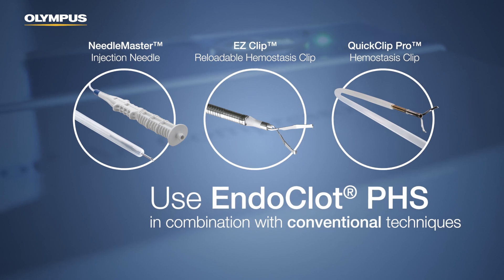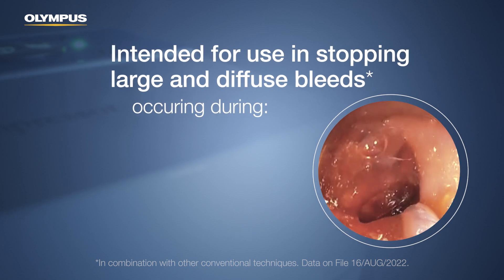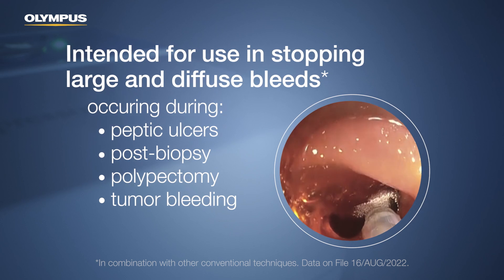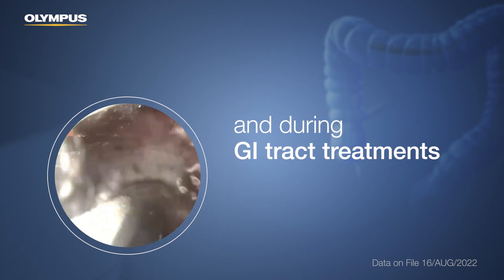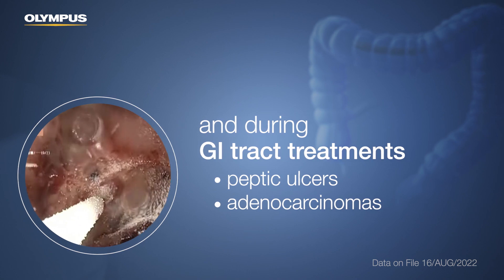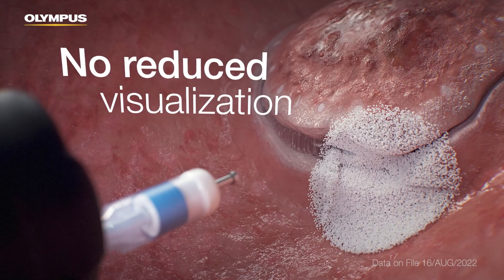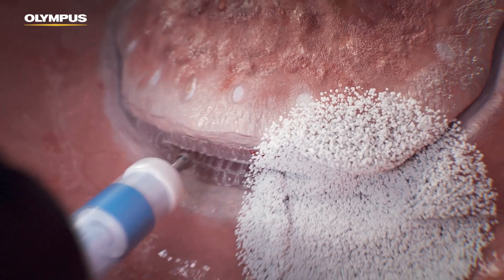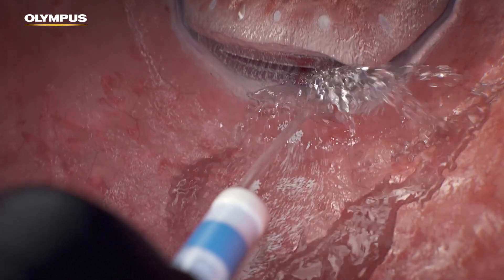It is intended for use in combination with other conventional techniques for large and diffuse bleeds, such as those occurring during peptic ulcers, post-biopsy, polypectomy, tumor bleeding, post-EMR, and ESD. Endoclot PHS is also indicated to stop bleeds while treating peptic ulcers and adenocarcinomas in the GI tract. It can be applied directly to the targeted site without reducing visualization, designed to allow further therapies to continue the procedure. If needed, Endoclot PHS can be irrigated after hemostasis has been achieved to verify all bleeding has been resolved.